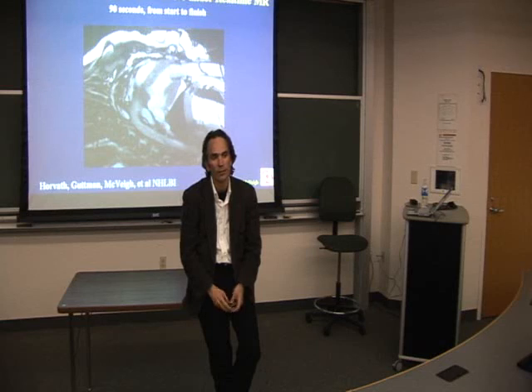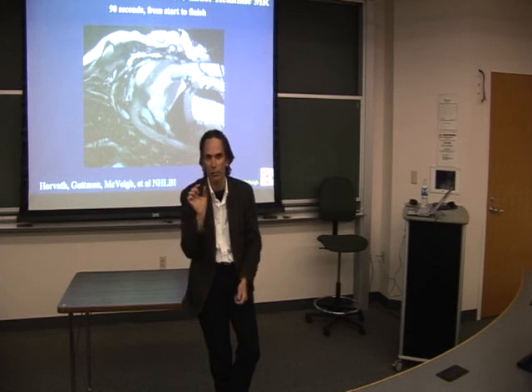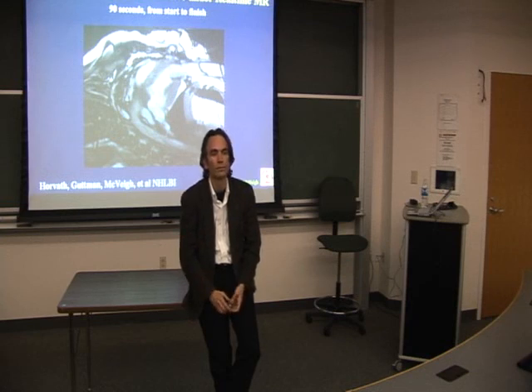Just a question. Do you perform any coronary procedures using this, or do you think it's technically ready to use? I don't know if they will ever use it actually. The thing about the coronaries is, other than CTO, other than trying to pass a blocked coronary, all you want to do is put in a stent, and you actually can see where the coronary is with fluoro. I mean, it's a 1D object. You squirt dye in it, and you can see it.